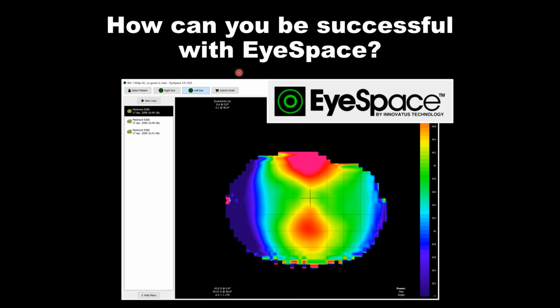Now, with the EyeSpace software, one of the ways to be successful is taking good maps. I know that sounds so fundamental, but really, if you import in good quality topography, then the EyeSpace software has an easy time building the lens in 3D space. So I cannot stress enough how important it is to have good quality corneal topography mapping.